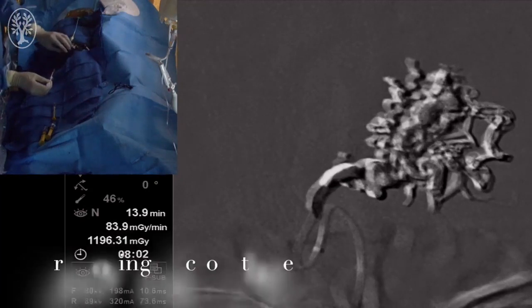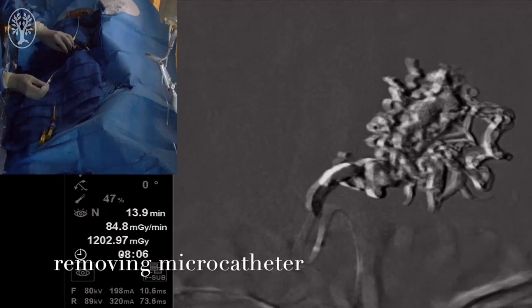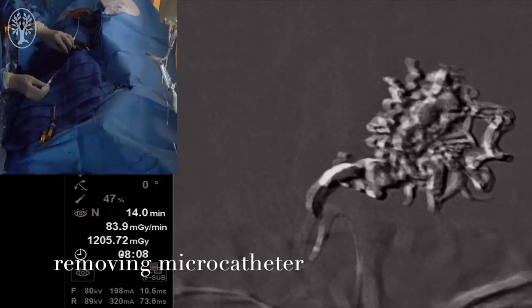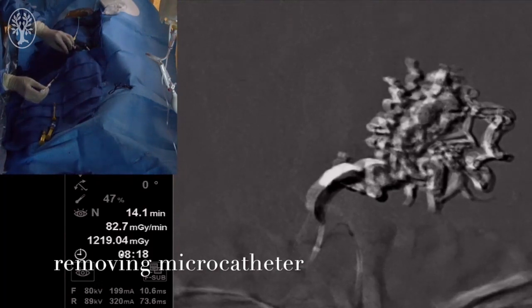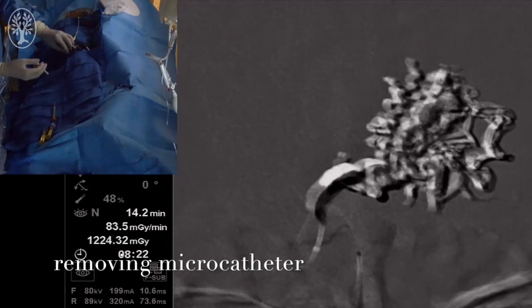Once we feel we've injected to the maximum capacity or we have achieved the result we were looking for, we begin to remove the microcatheter. Occasionally the microcatheter can get stuck, and we then use slow tension to remove the microcatheter, or even sometimes we may inject some DMSO to break up the glue adherent to the catheter, causing the catheter to be stuck.